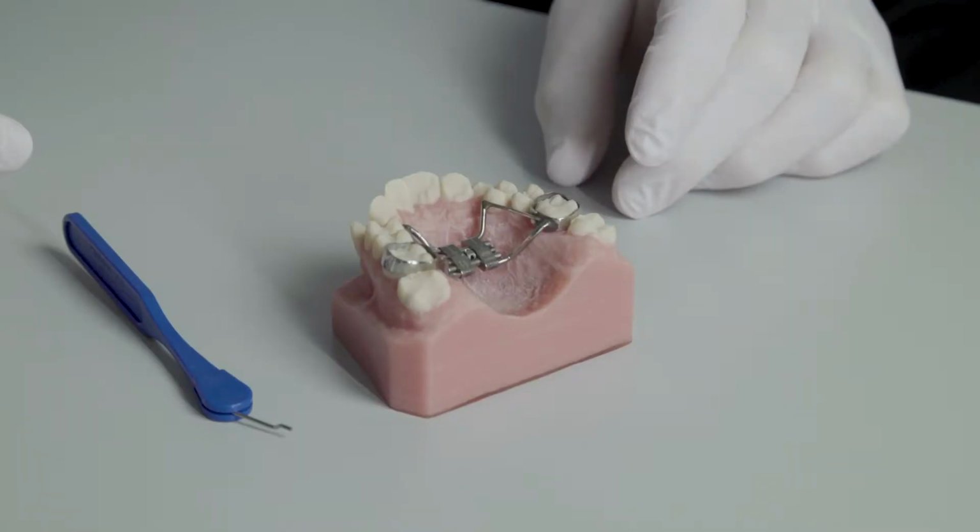This appliance is typically bonded to the top back teeth and is used to widen the top jaw. This is done either to fix a crossbite or help create space for alignment of the teeth. First, I'd like to show you how the appliance works outside the mouth.